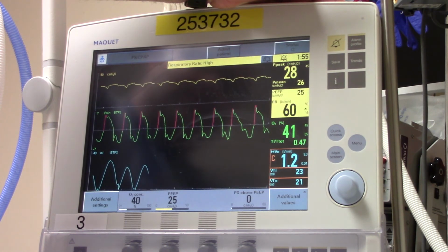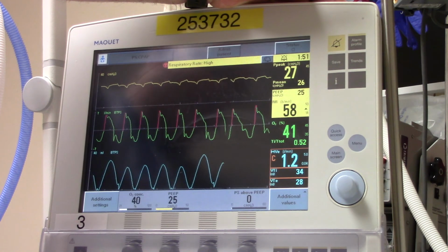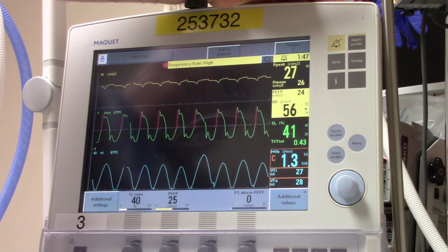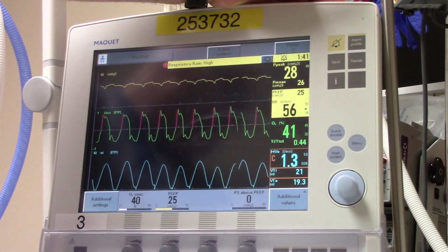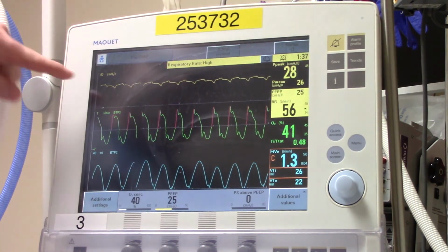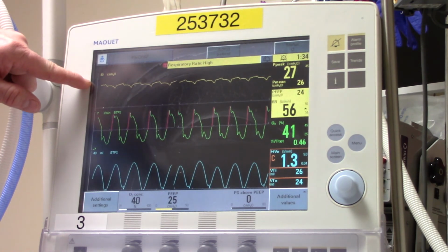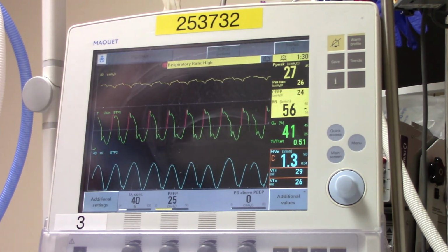This is key to a better technique of both trying to hold the inspiratory volume over a longer period of time, as well as making it comfortable for the patient during that phase, or at least more comfortable for the patient. And you notice the peak pressures are not spiking nearly as high as they were before when the patient was trying to breathe against the closed valve.